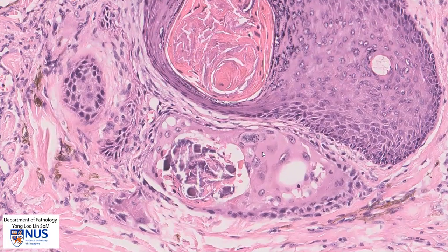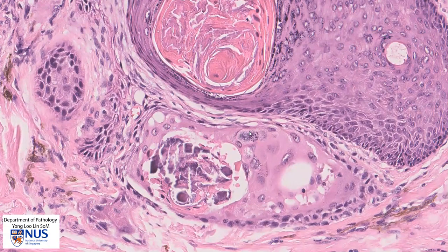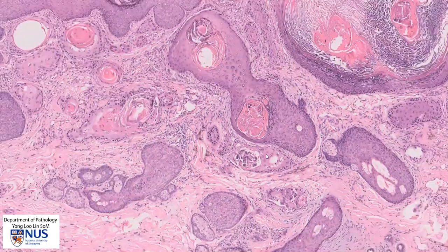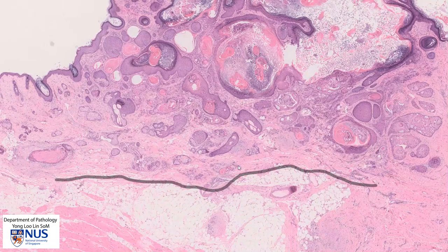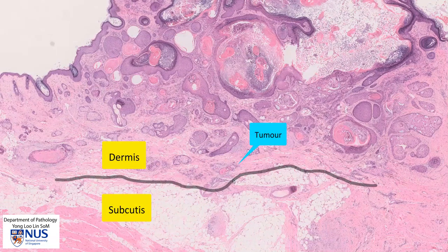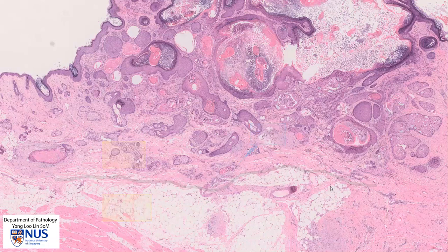Looking at some of these nests of tumor cells, we can see that there is quite significant nuclear enlargement and pleomorphism. We can also see that the tumor extends right into the deep dermis, and it doesn't infiltrate into the subcutis in this particular section.